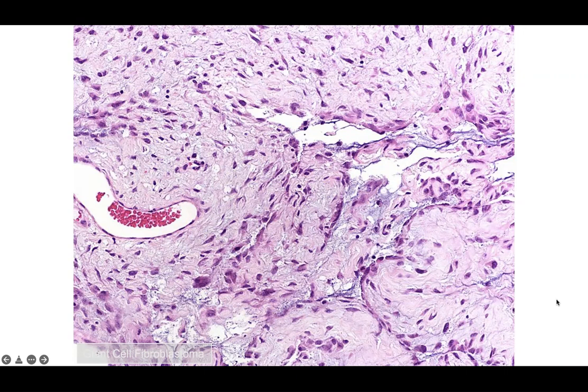Giant cell fibroblastoma. So again, I think what could be helpful here is just seeing that you have a pretty high ratio of the cells being classified as giant cells, and then you've got that fibroblastic stromal proliferation in the background. And I would probably consider doing a CD34 on this right off the bat to show that, yes, it's positive for CD34, because again, that's going to be very similar to DFSP. And then maybe also sequencing it just to see if you do have a translocation in the background.